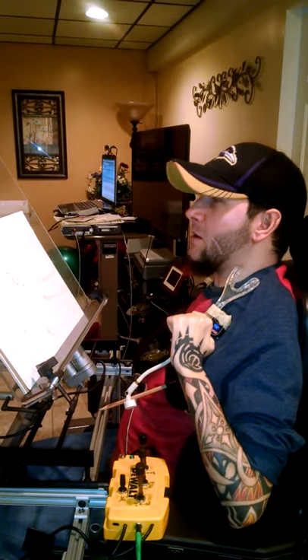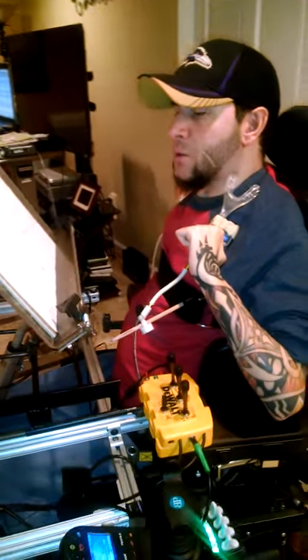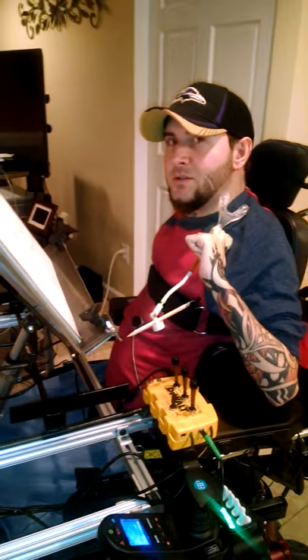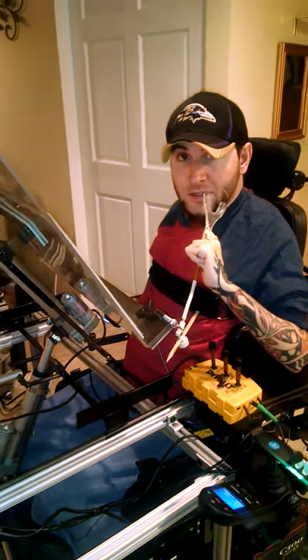Alright, this is Robert Florio. V-Link just brought me my new actuator-controlled easel. I just had surgery on my neck, so let's see how it works. I needed this thing.